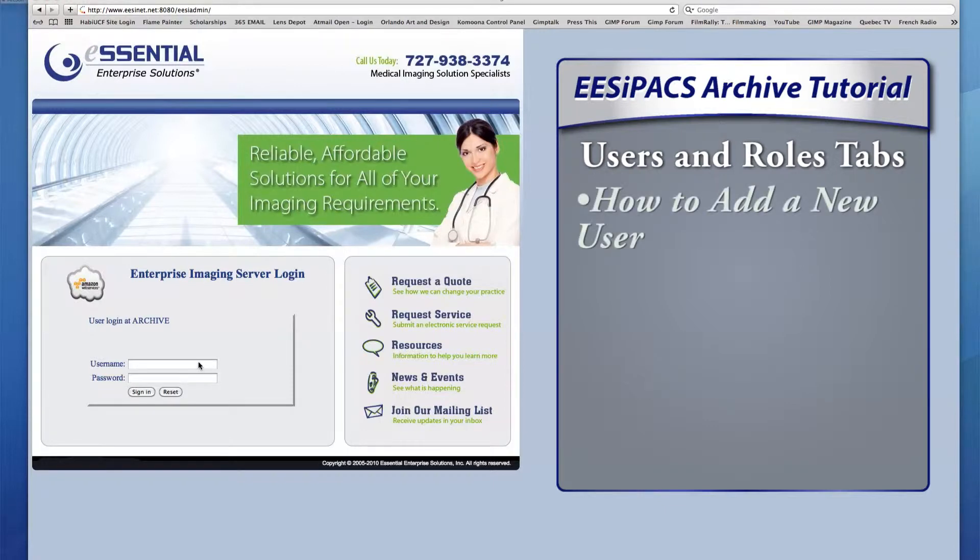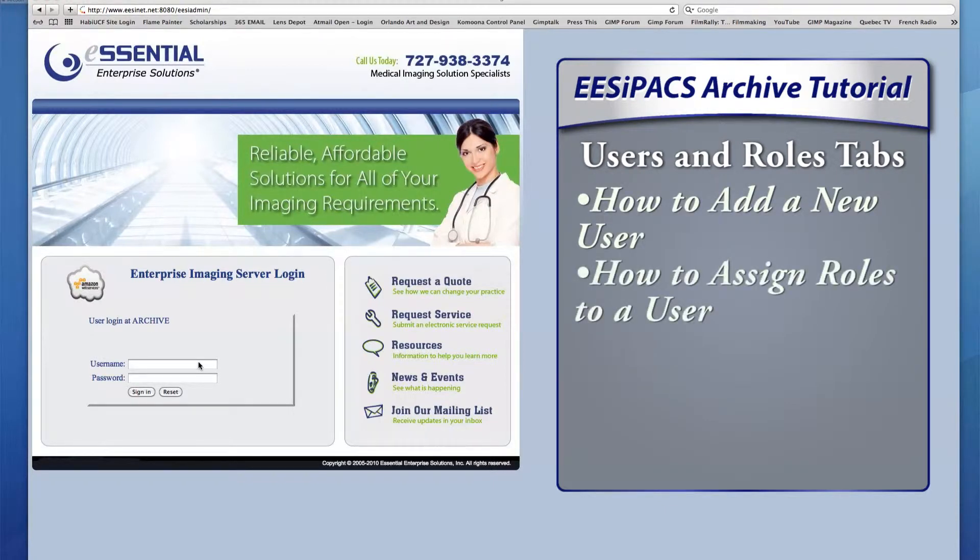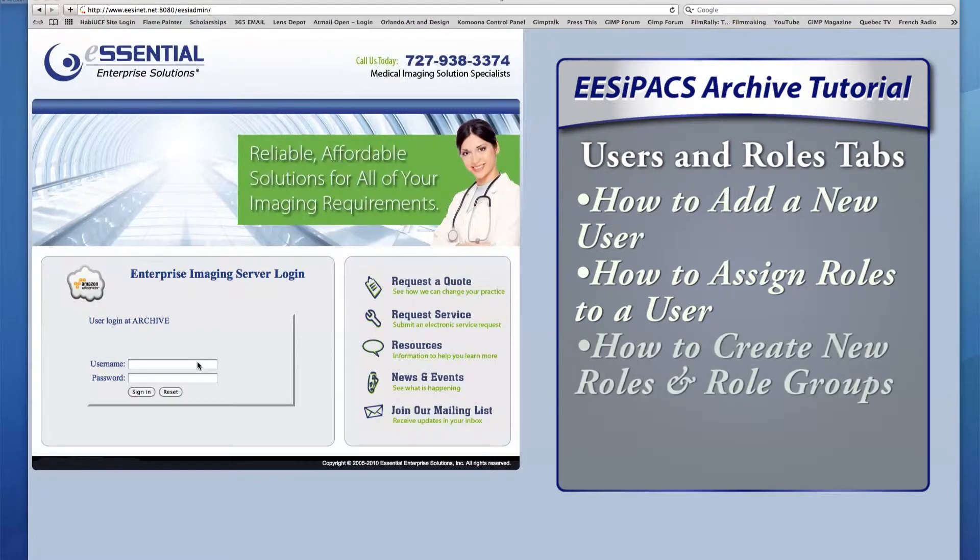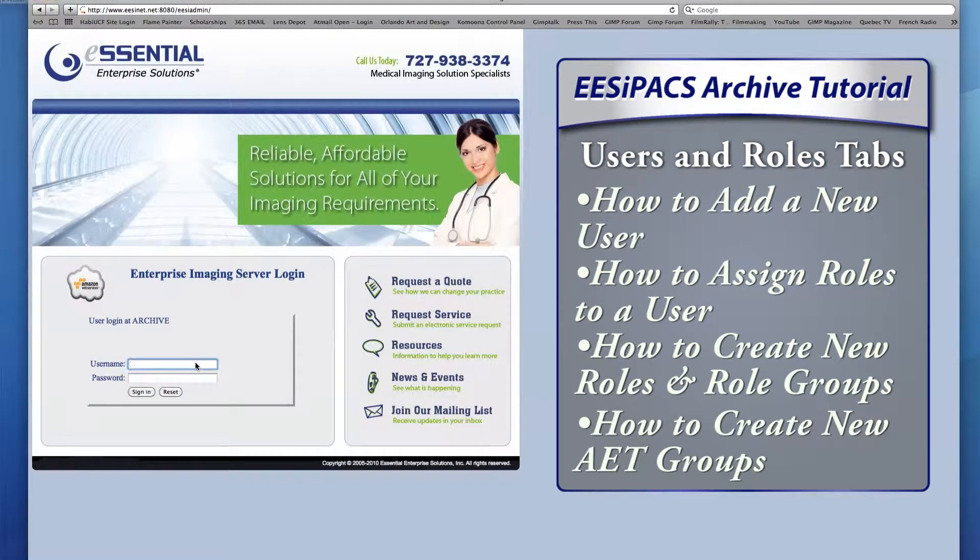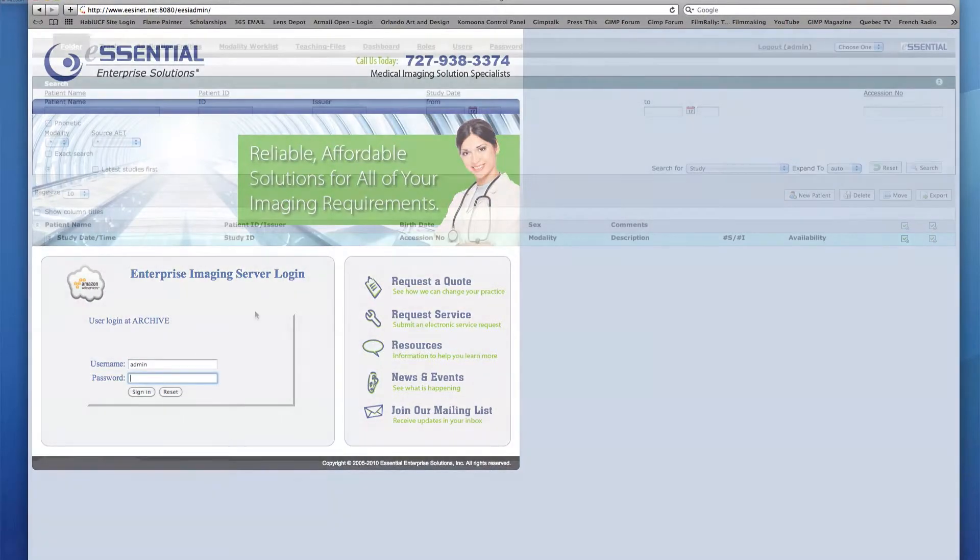I'll demonstrate how to add a new user to the archive, assign roles to that new user, create new roles and role groups, and create new AET groups. All of these features make it easy to tailor the accessibility of the information on the archive to each type of user.